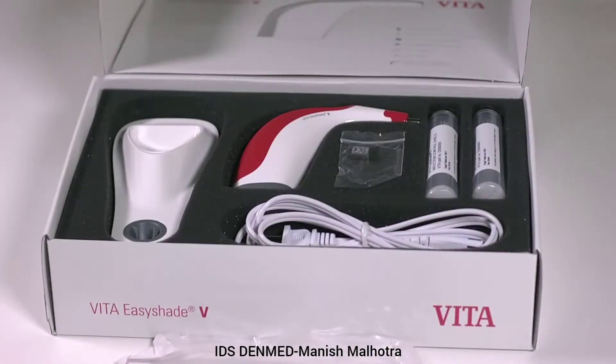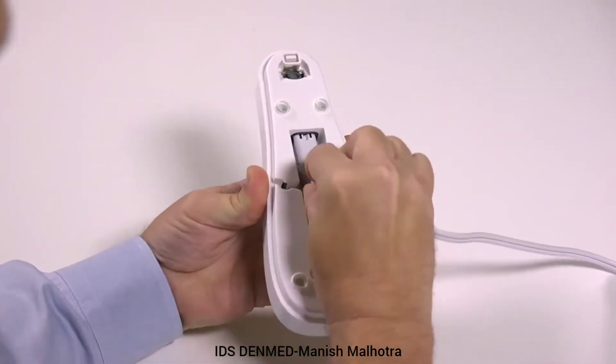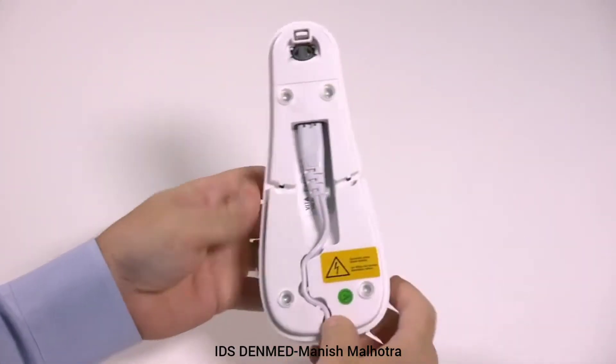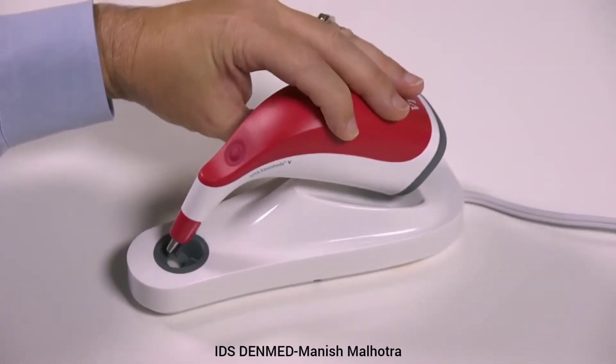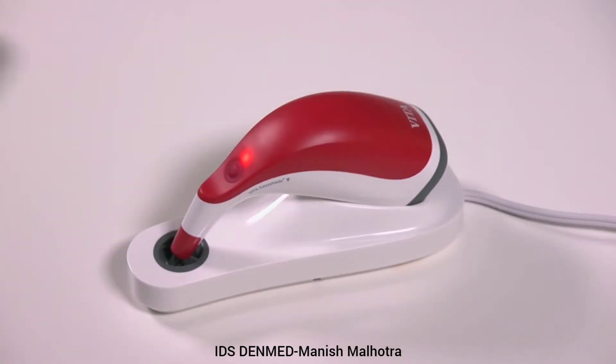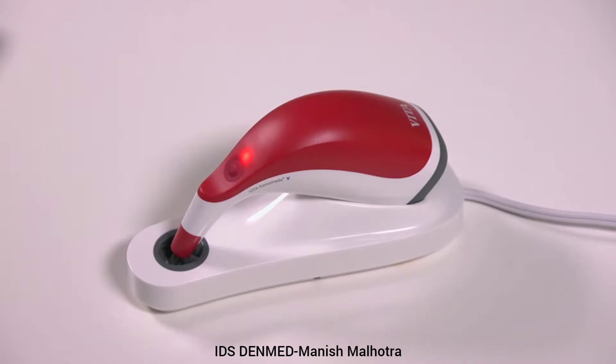After removing the EasyShade 5 from the packaging, the device will need to be charged. Connect the power cable to the bottom of the charger base and plug it into a standard outlet. Place the EasyShade 5 onto the charger base in the designated cradle area with the tip touching the calibration block. The device should be charged for a minimum of 12 hours. The device batteries are charged via inductive charging. A light next to the measurement button will highlight showing a positive charge.